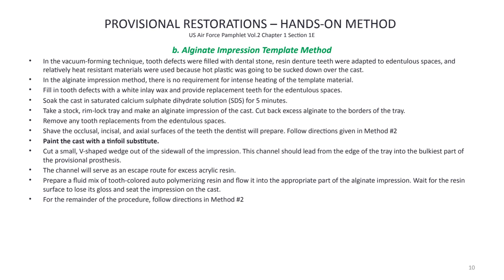The only thing that we have to be aware of is that once we start taking the alginate impression, we have to work pretty fast because the alginate impression is a hydrophilic material. It likes water. And once the water evaporates from the material, that alginate impression material is going to shrink and is not going to be accurate. So once we start the procedure, we have to go ahead and finish it.